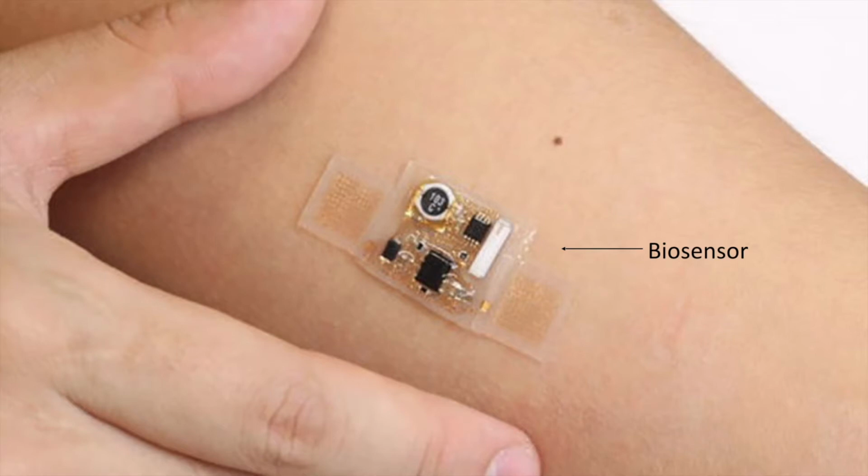Biosensors are devices that are designed to detect a specific biological analyte by essentially converting a biological entity, that is protein, DNA, or RNA, into an electrical signal that can be detected and analyzed. In terms of cancer, the analyte being detected is a tumor biomarker. By measuring levels of certain proteins expressed or secreted by tumor cells, biosensors can detect whether a tumor is present, whether it is benign or cancerous. Optical biosensors are based on the phenomena of surface plasmon resonance techniques.